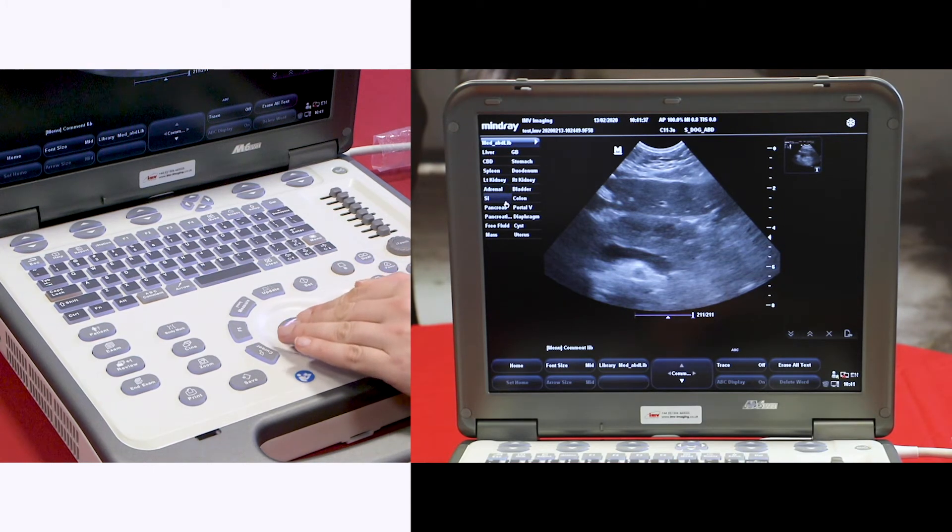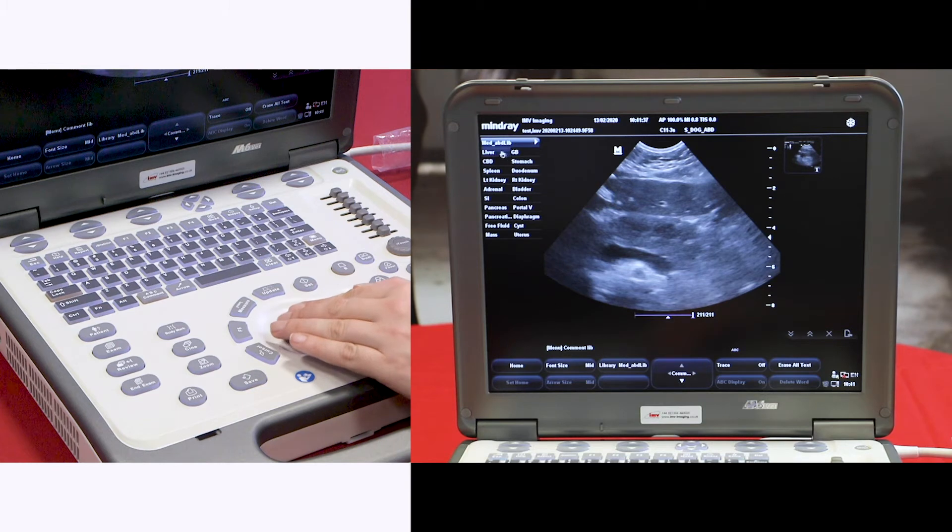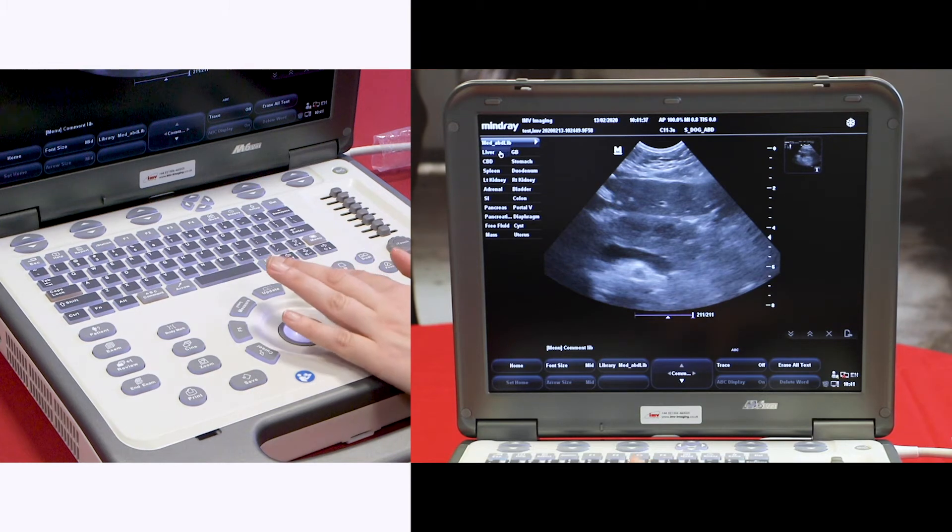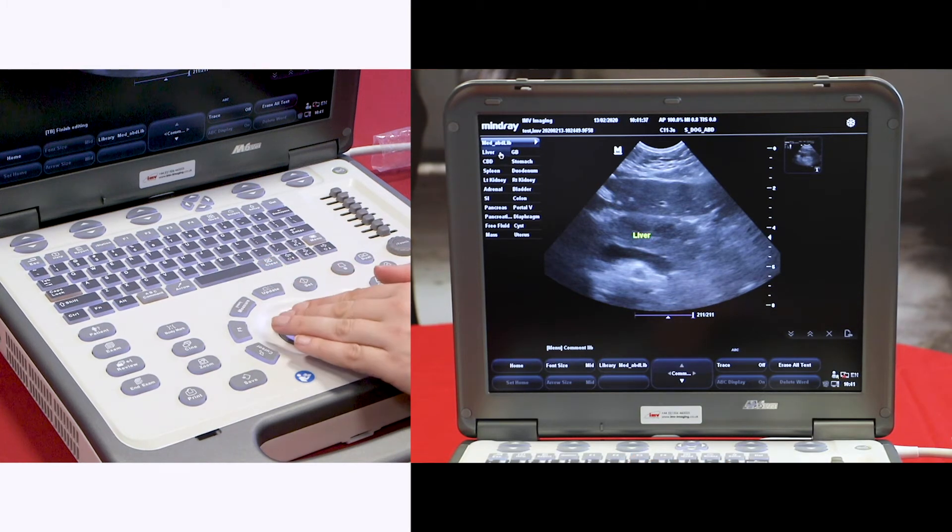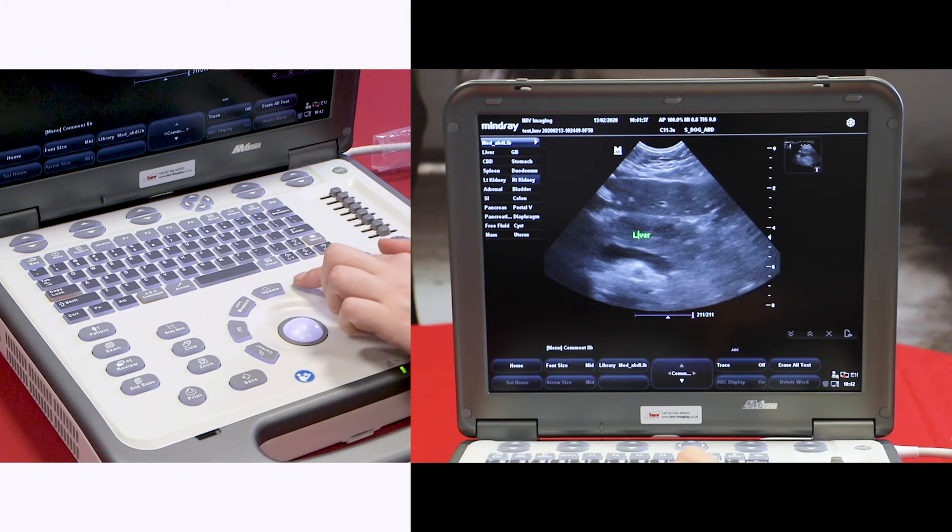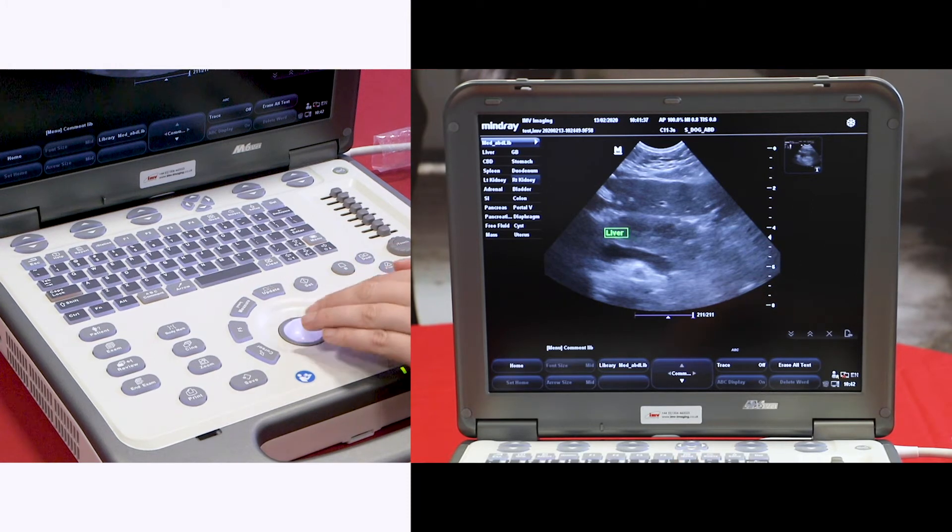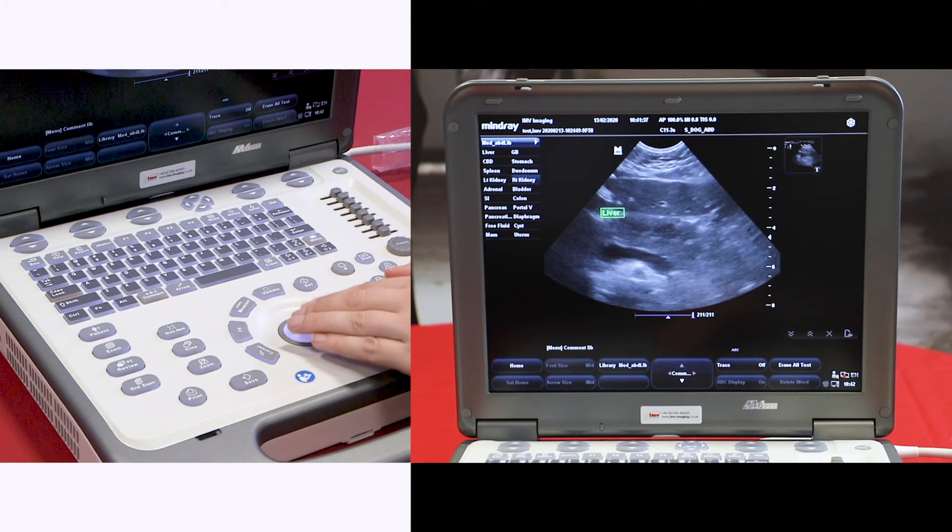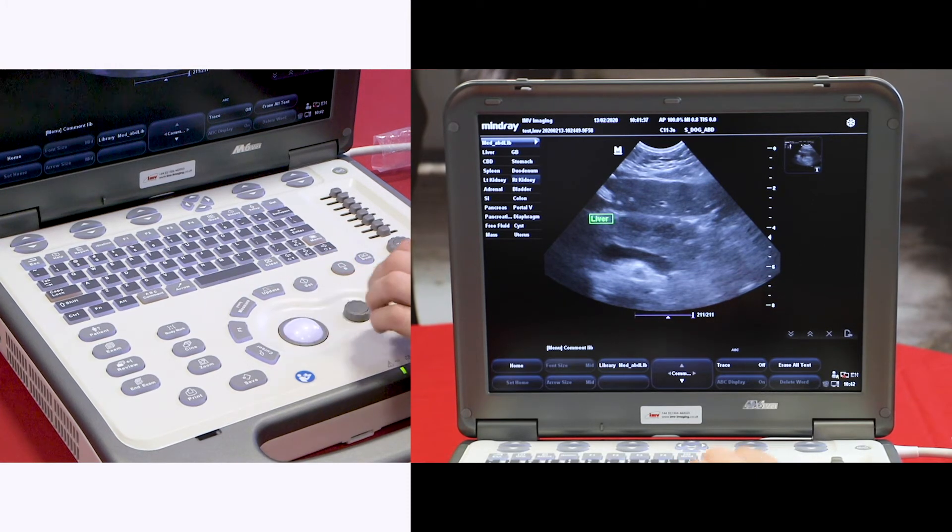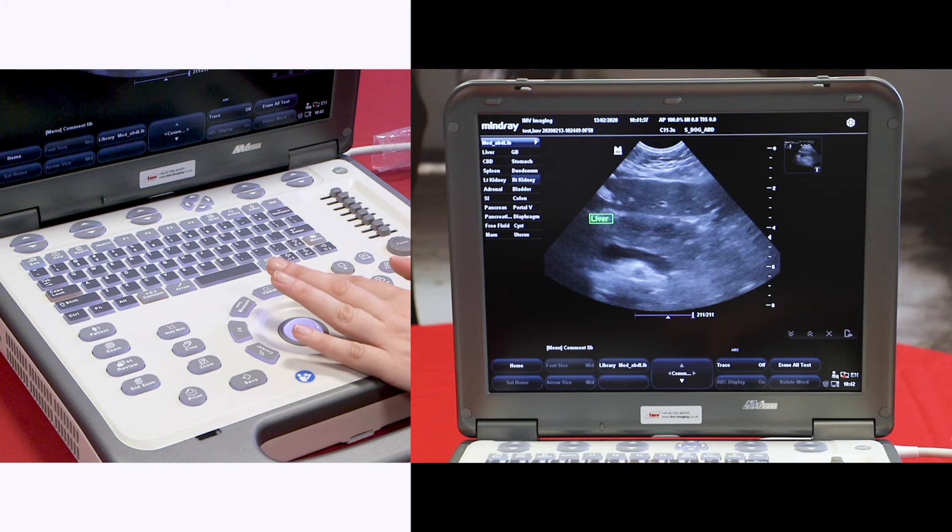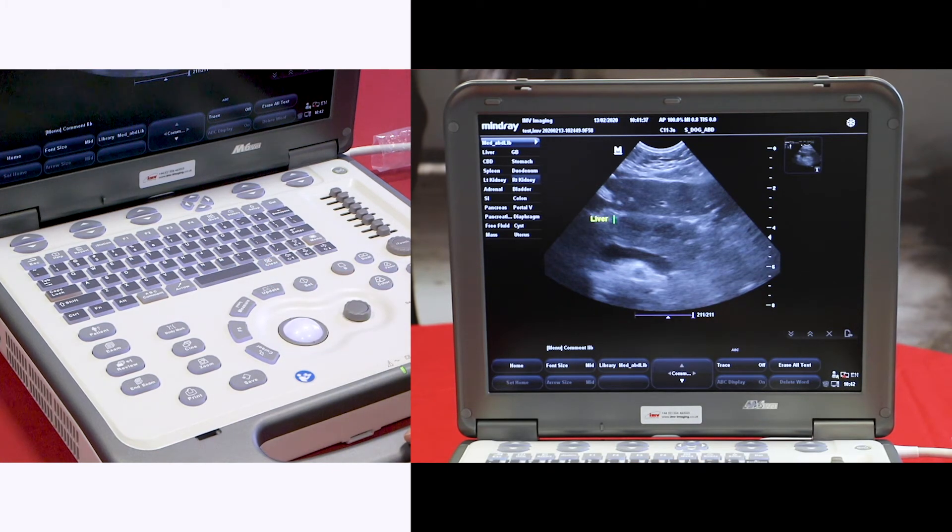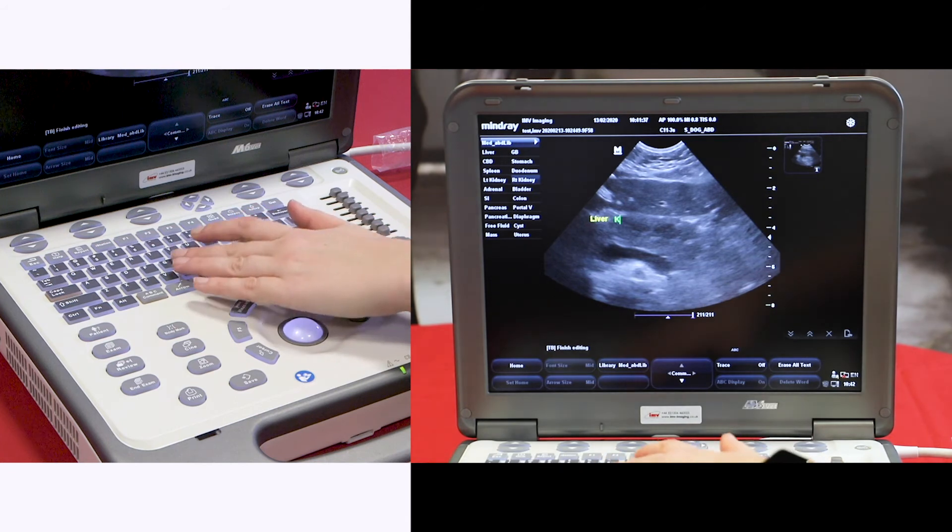Here you can add the appropriate label. You can scroll over and press set to move the comment, and press set again once you're happy with where it is. Alternatively, you can type directly on the screen.